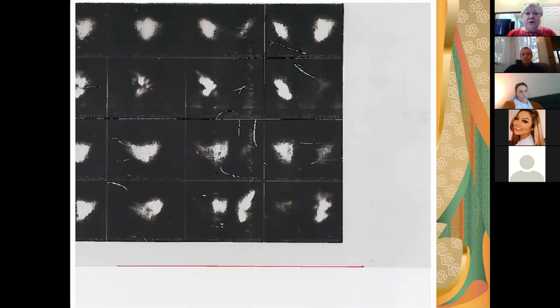But these right here are the two lungs. So look, this lung picked up the isotope, but this lung did not. It picked it up here. It did not pick it up here. So the fact that not both lungs were picking it up made this, the vascular side, the perfusion side, a high probability of a PE, VQ scan.